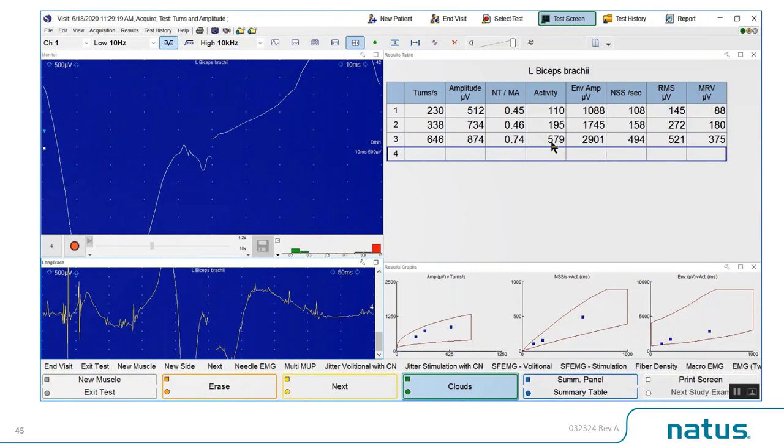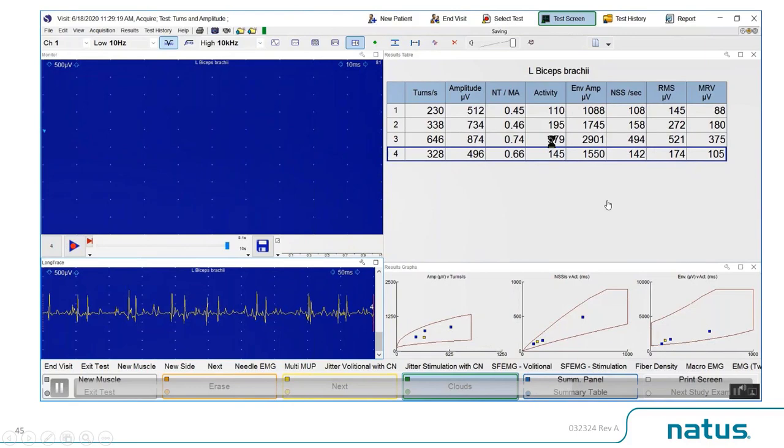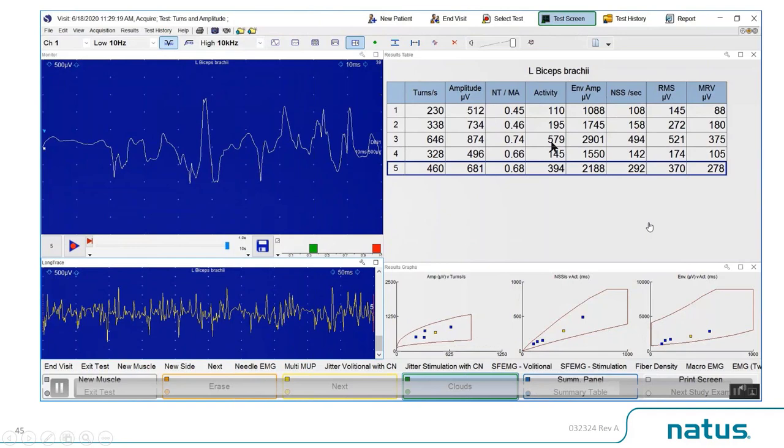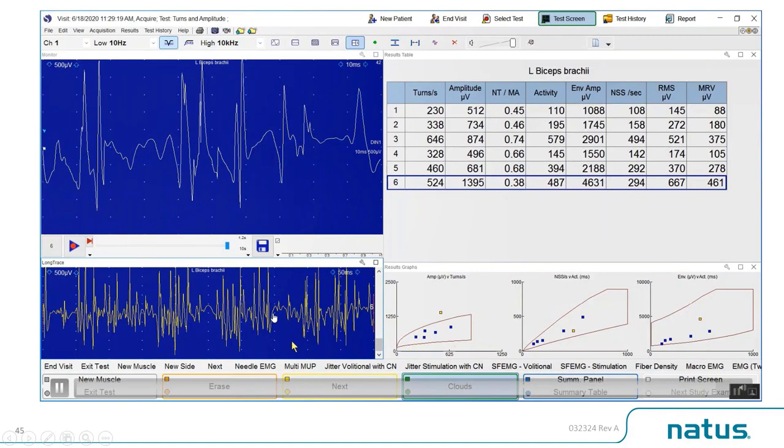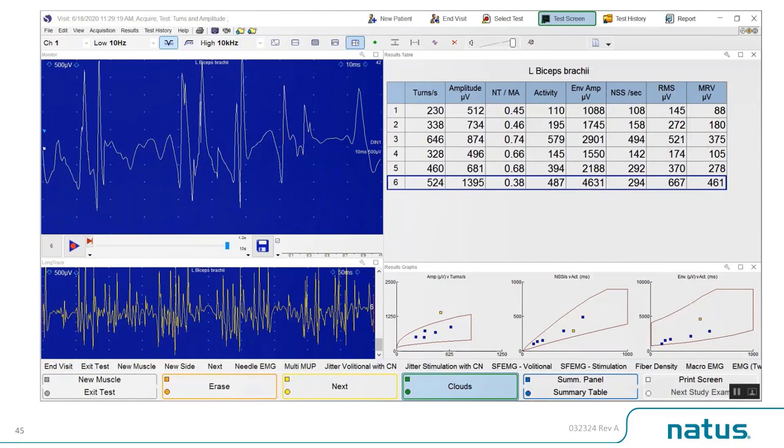Another side: slight effort, moderate effort, and maximum effort. This is where you have to be careful. Sometimes you get a full activation of another muscle or a tremor-like pattern, and you can see there is a gap in the baseline. This can generate neurogenic-like activities. So these days, we like to do most of our recordings at slight to moderate effort, and we do not like to use maximum force because this can create some abnormal patterns. That's just a cautionary warning.